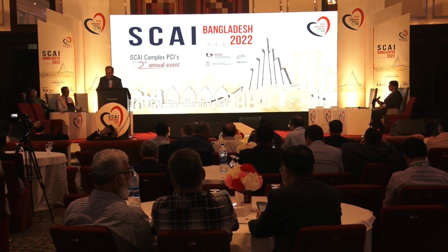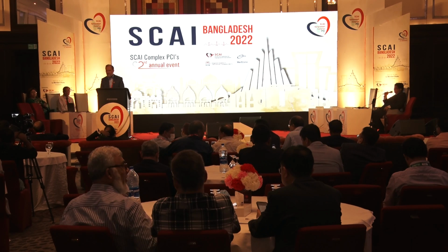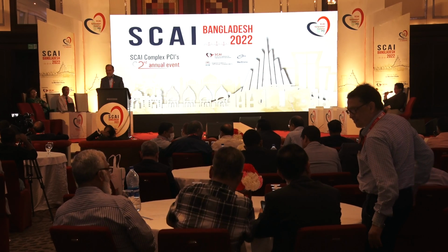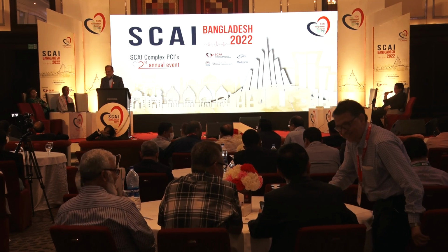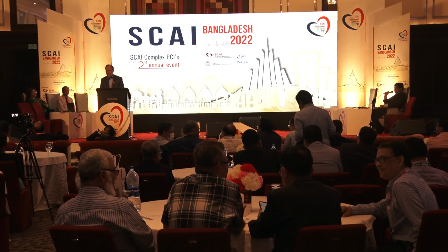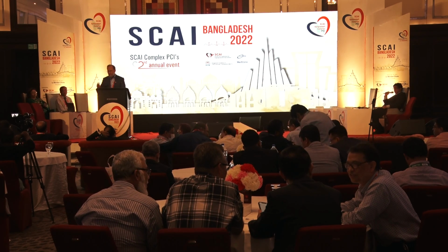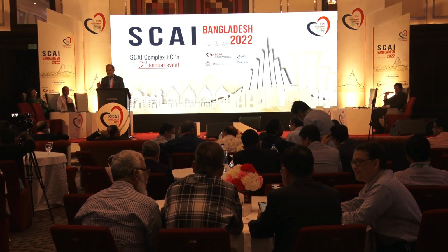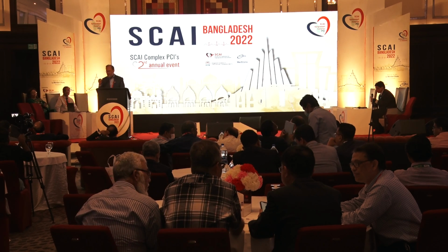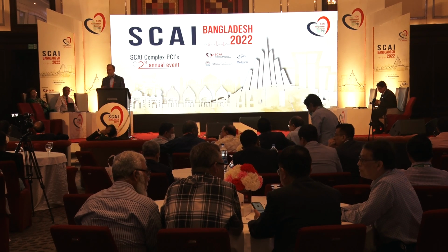Thank you for a nice question. For retrograde, especially if the antegrade attempt fails, if it is a long CTO, like more than 20 millimeters, with a blunt antegrade stump and good interventional collateral. Interventional collateral is a very important factor for retrograde. Then I'll go for retrograde. And definitely for planning, you have to take some views like RAO cranial or LAO caudal to see the origin of the collaterals. And you have to take a very soft wire to enter the collateral.